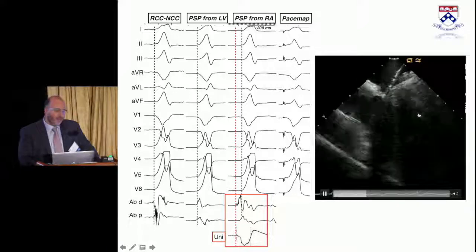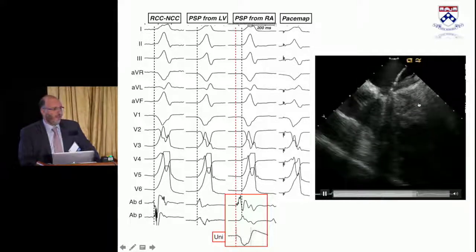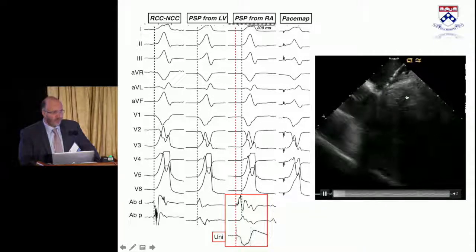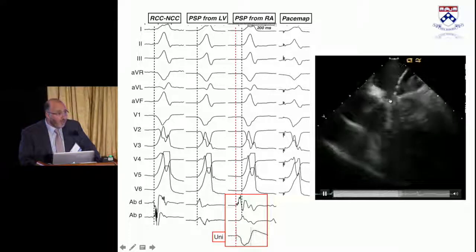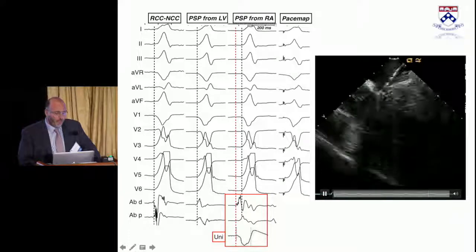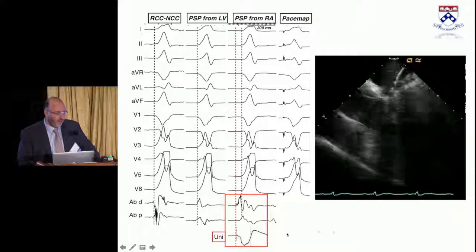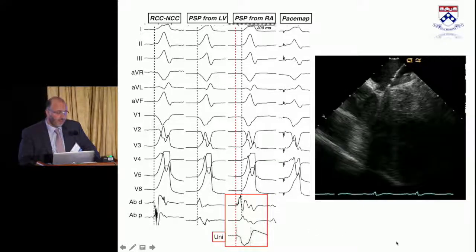And this is a learning point, because if you see this septum, we did a lot of ablation with irrigated RF, trying to get rid of the PVC, and it kept coming back. Look how swollen this tissue is. It would not happen today because I learned I have to map in different aspects. When we put the catheter here, this is the activation. It's way early with a very nice unipolar, a decent pace map, but we already know we don't use pace map in this area.